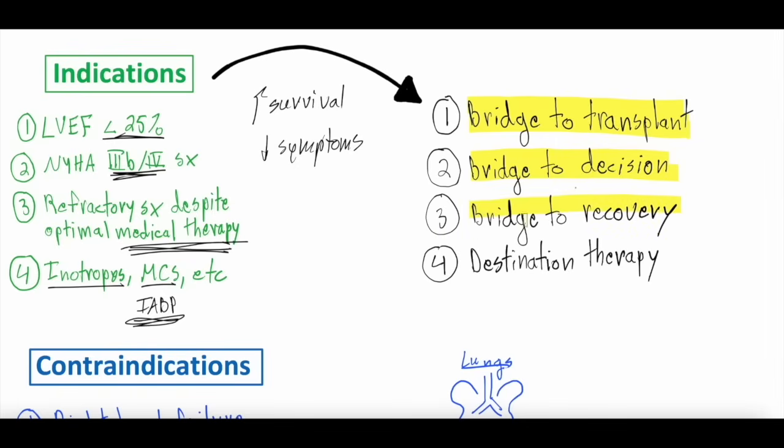Sometimes people's hearts get really sick, but if you expect that heart to recover, you can get an LVAD as a bridge to recovery. And then once you recover, you obviously don't need the LVAD anymore.